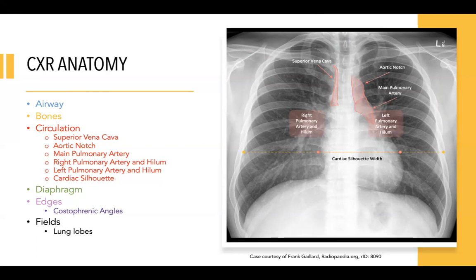In the absence of pathology, the diaphragm curves superiorly in the center, with the right side being higher than the left due to the liver. In pathologies such as pneumothorax or COPD, the examiner visualizes more than 10 ribs, and in conditions such as abdominal distension and atelectasis, fewer than 9 ribs may be visible on imaging due to diaphragmatic displacement.